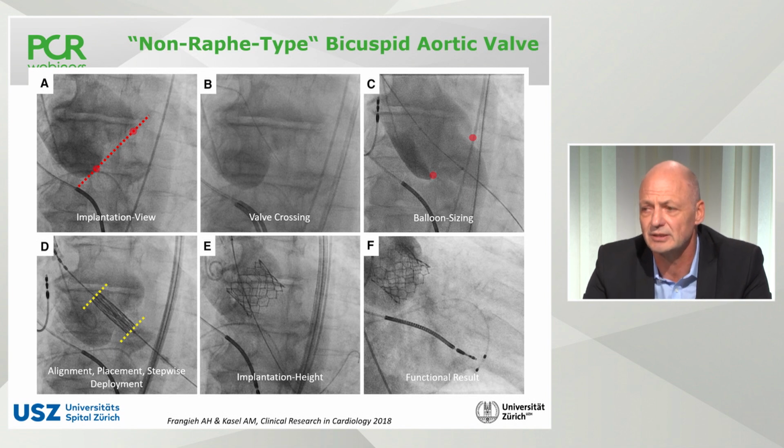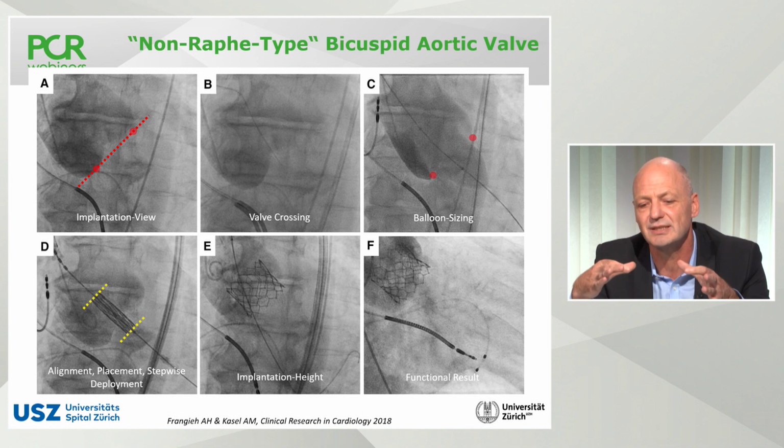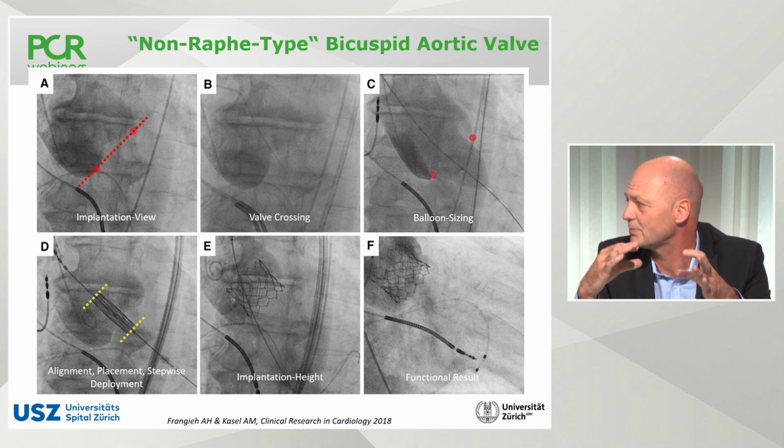We also published a sizing paper. I mentioned this. Is that the slide that was skipped? Should we quickly go back to that slide? I can describe it. We need 3 commissure points to three-dimensionally align an annulus, but we have only 2. So we align the 2 commissure points, and then we rotate around them and make multiple measurements, and the smallest annulus measurement that we get, we use for our valve choice.